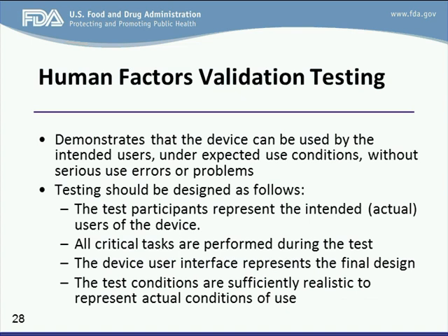Now, the goal of the human factors validation testing is to demonstrate that the user interface of the device can support the intended use, intended user, and intended use environment without causing serious harm to the user or patient. To achieve that goal, the testing setup should match the representative intended user, intended user interface, and intended use environment.